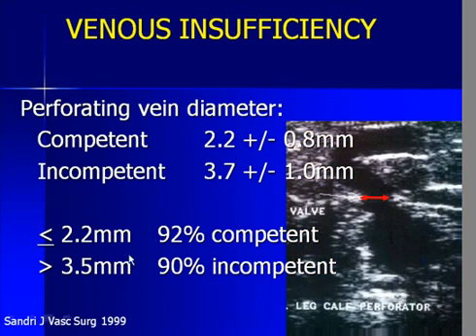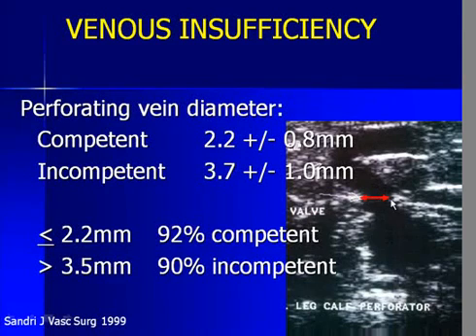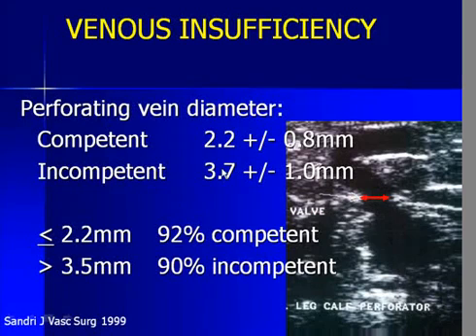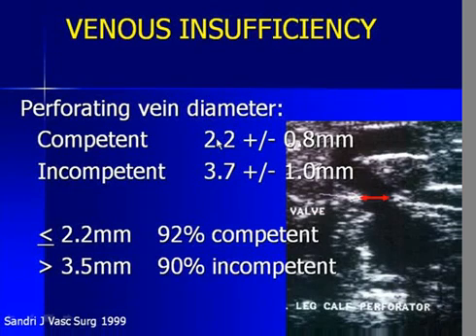This is an example of a very large dilated perforating vein — the deep venous system, the superficial system — measuring the lumen diameter where it crosses the fascial plane. This is where the valve normally exists, and looking at the diameter at that point you can classify it fairly readily just based on anatomic considerations into likely competent, likely incompetent, or transition region.